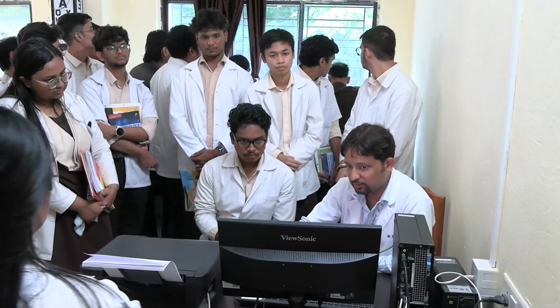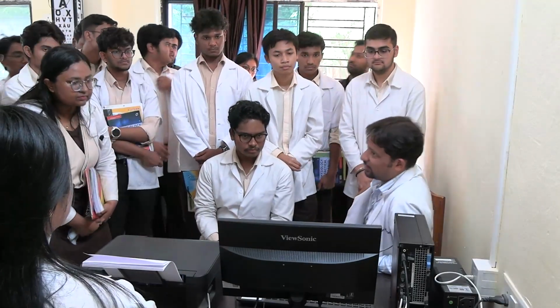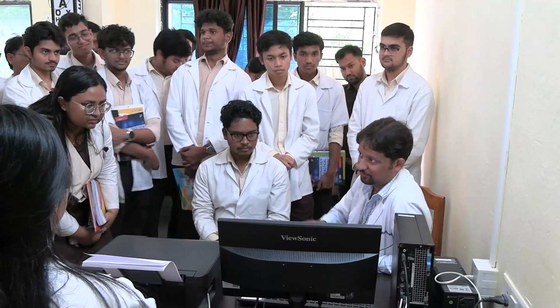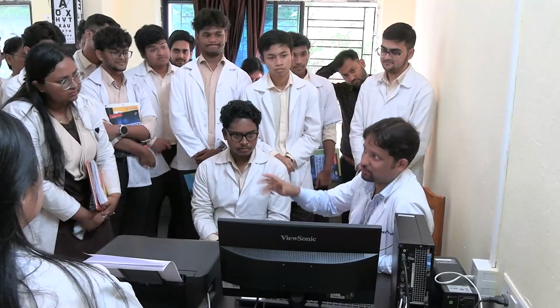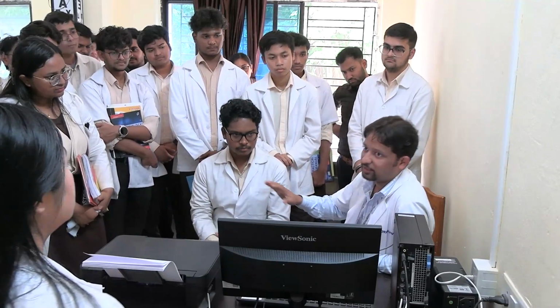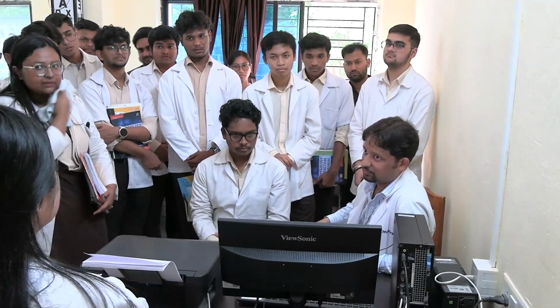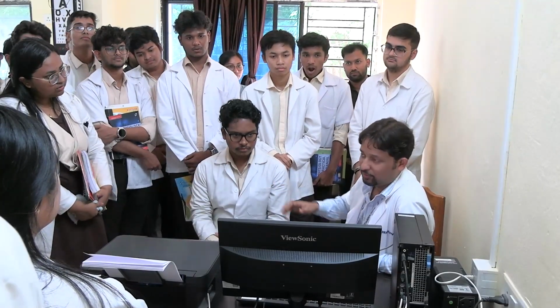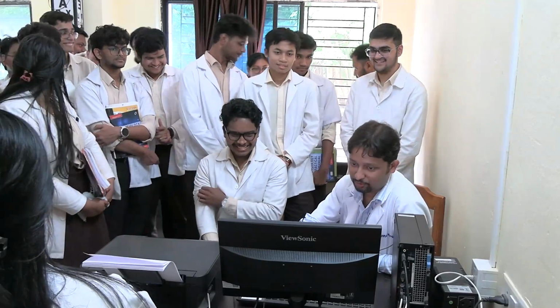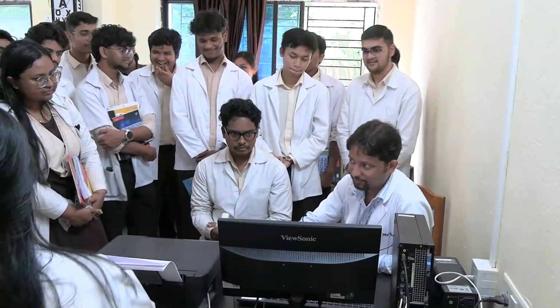So now you have two things. As per ATS guidelines, American Thoracic Society guidelines, 3 maneuvers are to be done, 3 acceptable maneuvers. And among them the best one is to be taken into consideration. And in between you can give 1 to 2 minutes break, pause. So I think we have given 1 minute break while talking. Again, wait. Go.